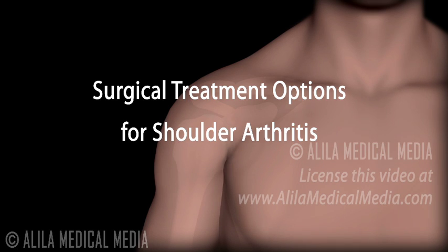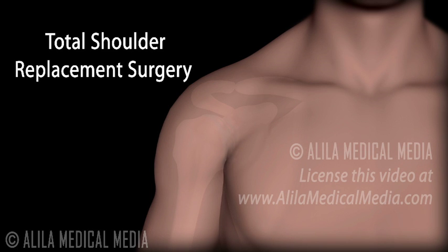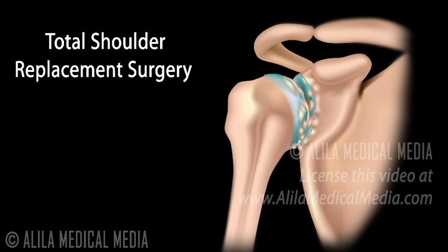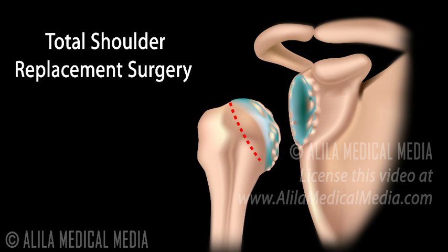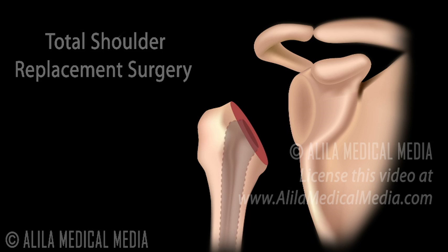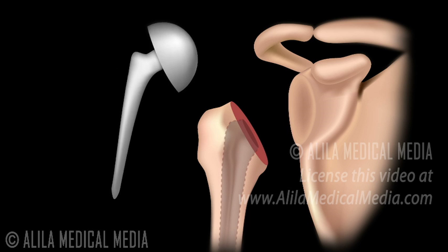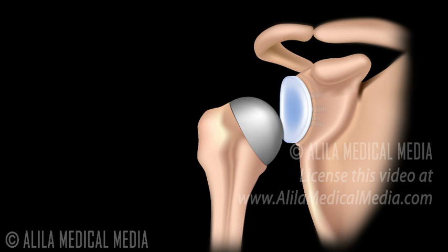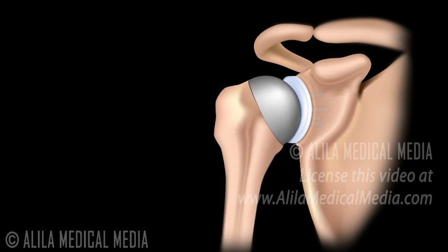Surgical treatments include a variety of procedures. Total shoulder replacement surgery is a well-established procedure performed to replace the diseased shoulder joint with artificial components. The damaged tissues are removed. The arthritic humeral head is replaced with a metal ball on a stem that fits inside the humerus. The socket is replaced with a plastic component made of high-density polyethylene.